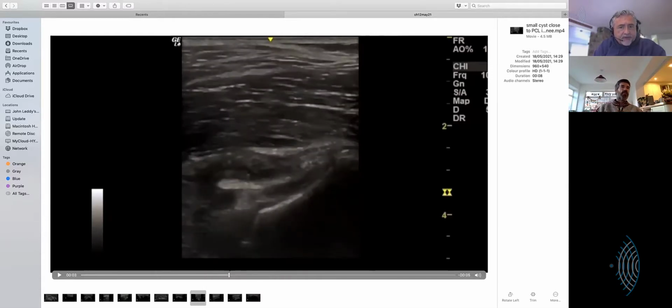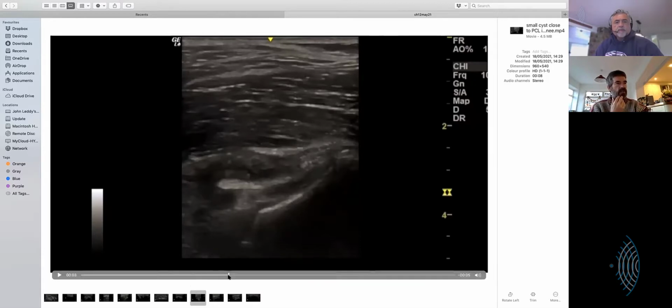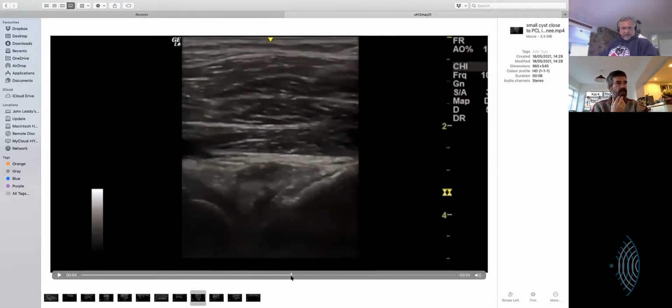Yeah. And so it's the humeral, I mean, it's the femoral condyles that are coming in on the bottom left. No, you're not seeing the condyle at all, I think, in that. Oh, yes, that right there. There, yeah, that's the femoral condyle.